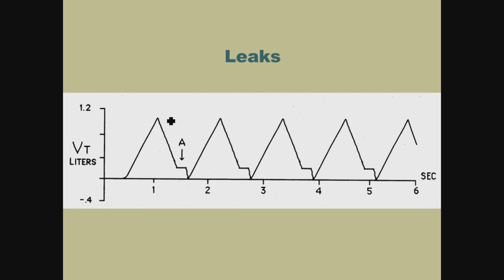So here I have my tidal volume of about 1,000. Good Lord Almighty, this is the old days. And I have some degree of leak here, about a 200 milliliter leak. And I'm able to quantify it in the process.